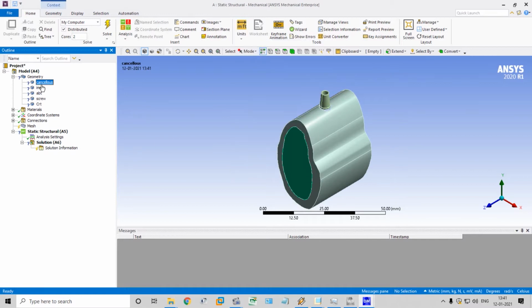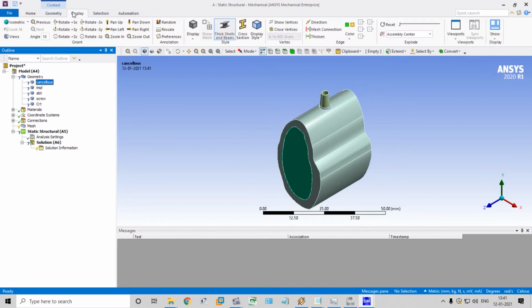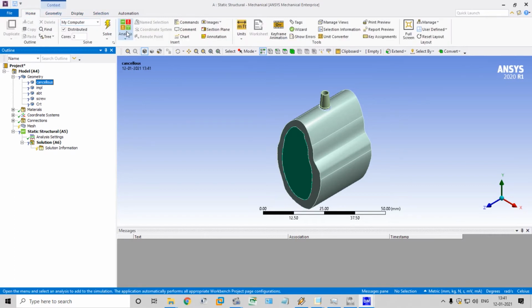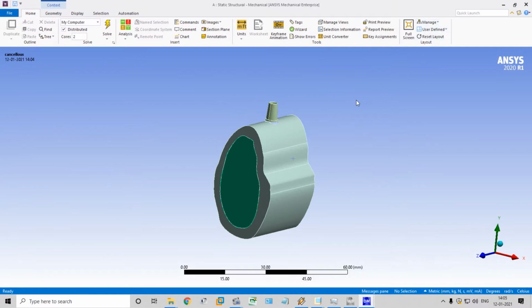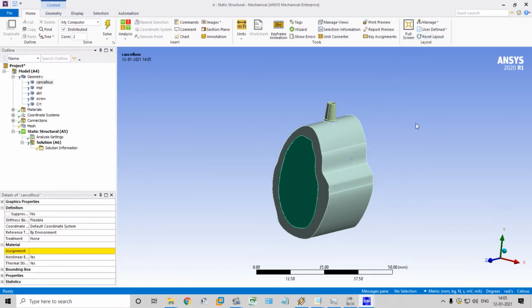Okay, these are the display factors. Manage views. If these menus are changed, just click reset layout, it will be completely restored to original position. Then we have to map the material, engineering materials to the 3D models.